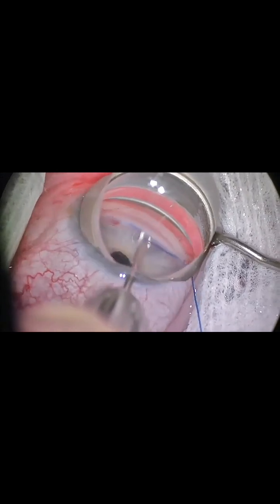As you can see here, the other end of the suture is coming out from the other end of our incision.